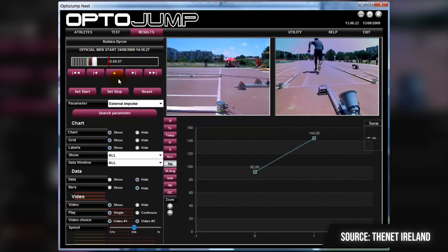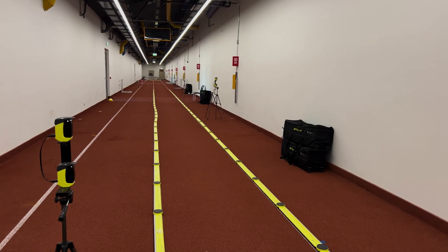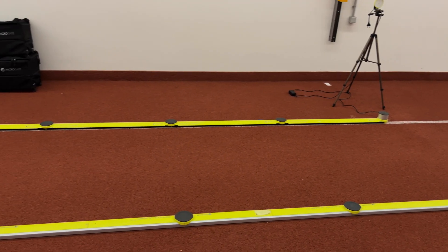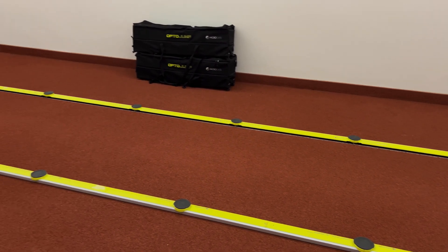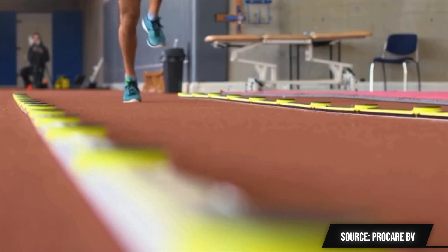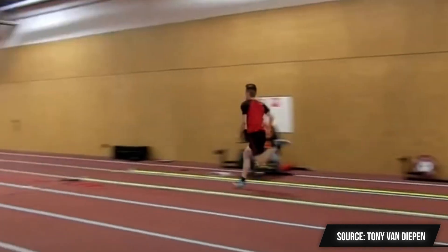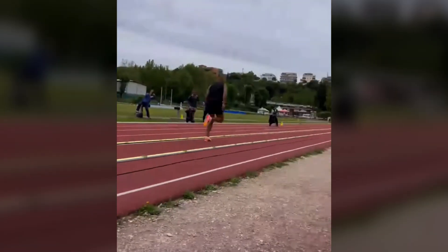Besides jump testing, there is something really impressive you can do with the OptoJump, but it does require the 5-meter setup or even longer. Depending on the length of the setup, you can use the OptoJump to create acceleration profiles, max velocity profiles, or even full sprint profiles that will help you detect athletes' weaknesses but also their strengths and what makes them unique. These types of speed, acceleration, or sprint tests are regularly done by professional sprinters like Marcel Jacobs and others to track if their training is successful.